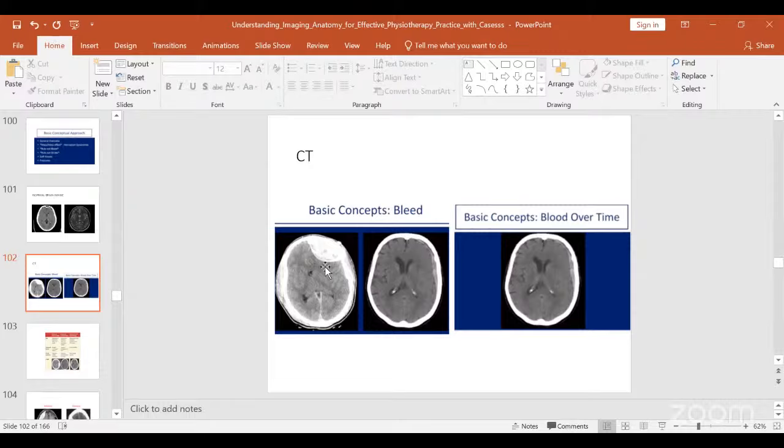It's frontal. Frontal. That's the location. I agree with you. Subdural. Why do you say subdural, sir? I can see it's extending from the periphery to the meninges, the brain meninges, the subdural area. That's why I say subdural.